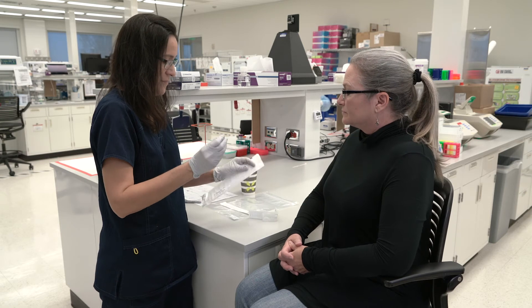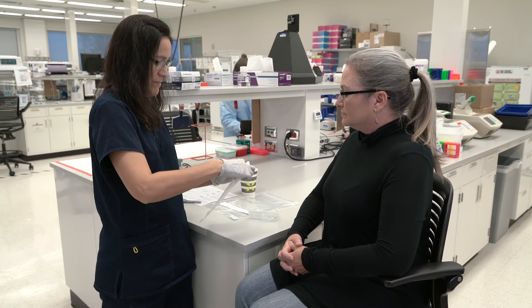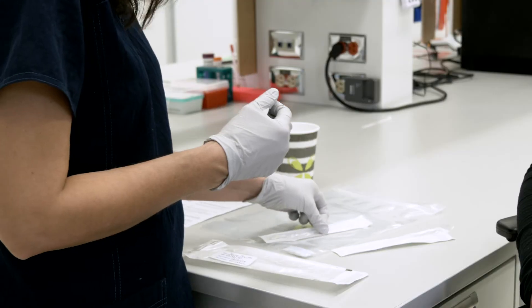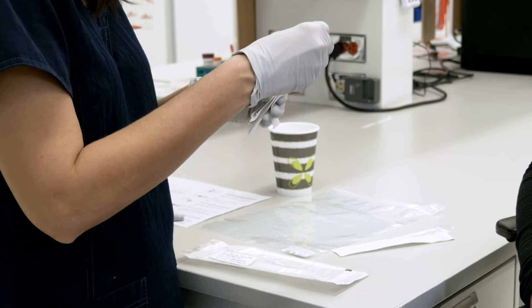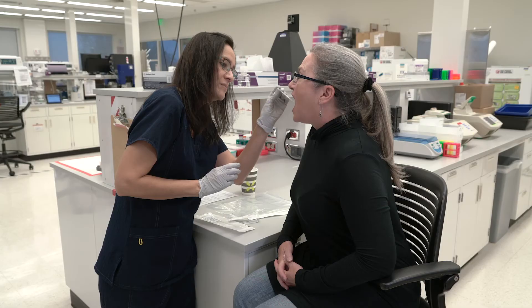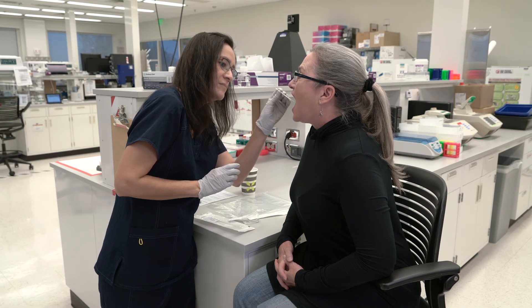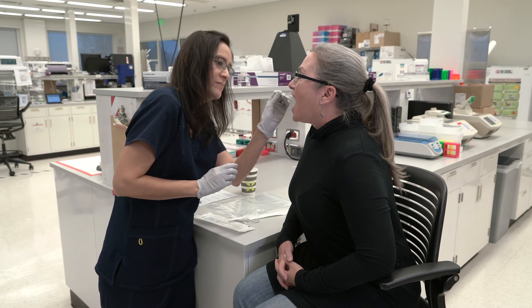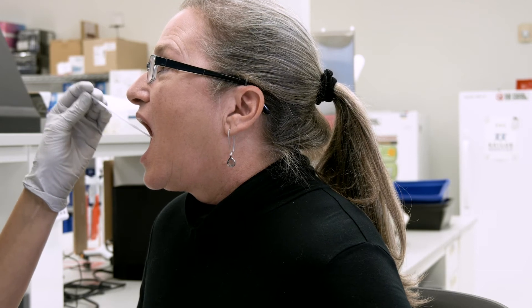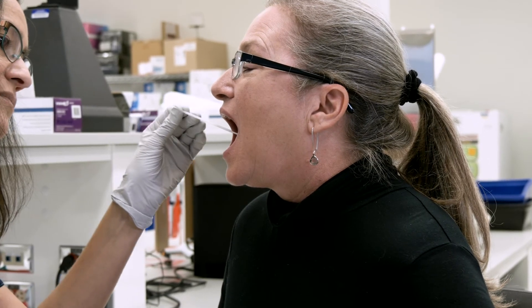Place the DNA collection swab into the small clear dry pack envelope tip first. Now remove the second swab, remembering not to touch any surfaces with the DNA collection tip. Rub the DNA collection swab up and down against the other inner side of the cheek 30 times, rotating the tip occasionally as you did before. Remember to use slight pressure to collect the maximum number of cells from the cheek surface, but don't cause any discomfort. Again, also rub inside the gum line to collect as many cells as possible.